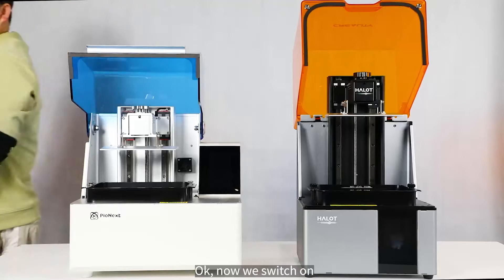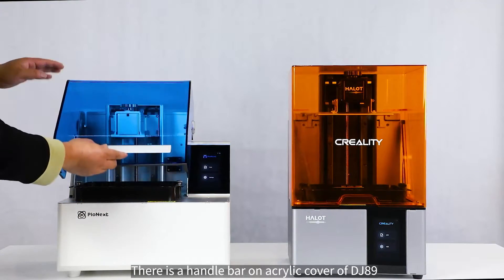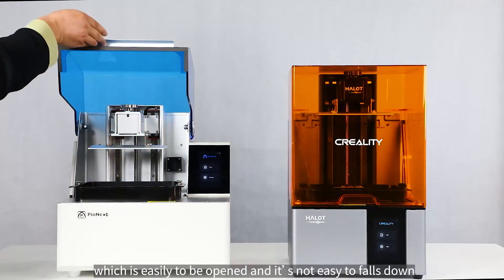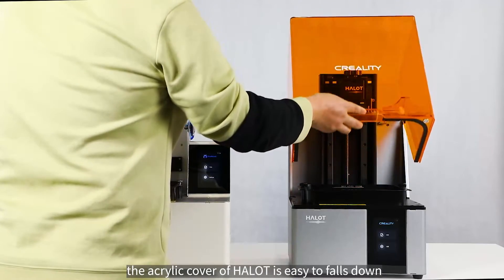Okay, now we switch on. There is a handlebar on the acrylic cover of DJ-89, which is easy to open and not likely to fall down. The acrylic cover of HALOT is easy to fall down.